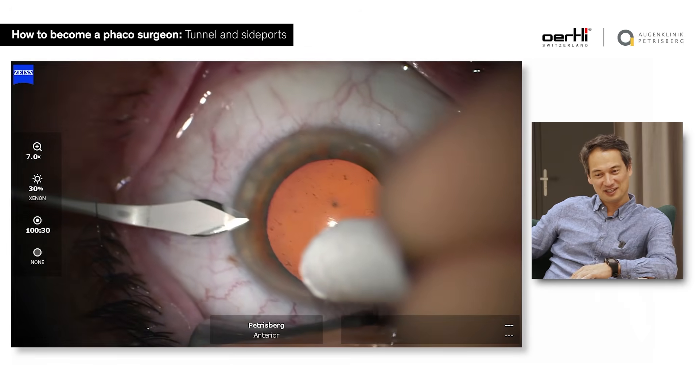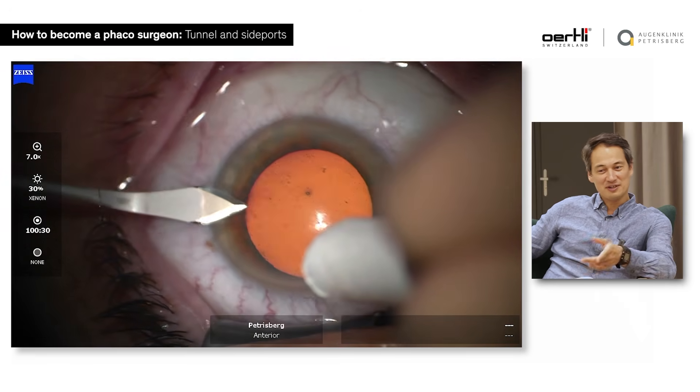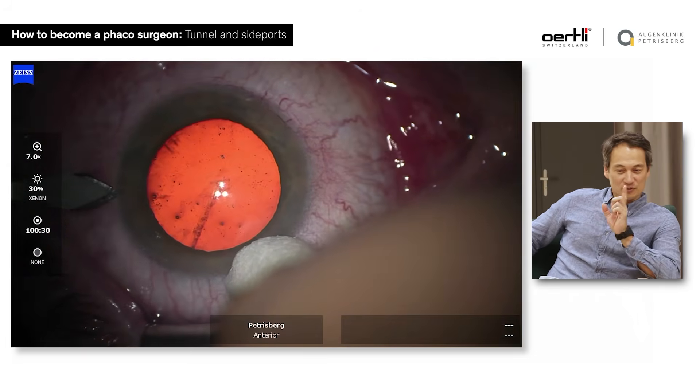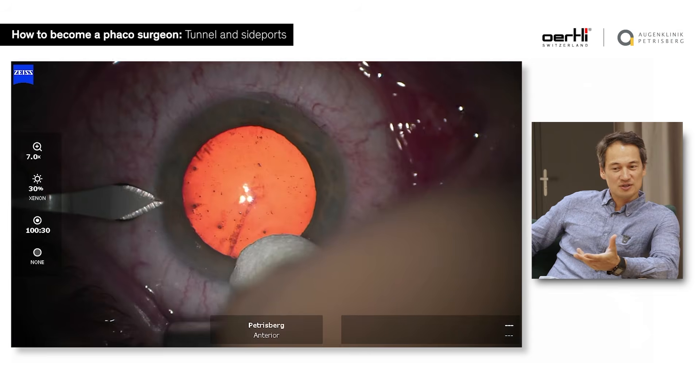Oh, look, that's a good one — this is a good tremor. You don't need phaco. You need to find your position of the armrests.